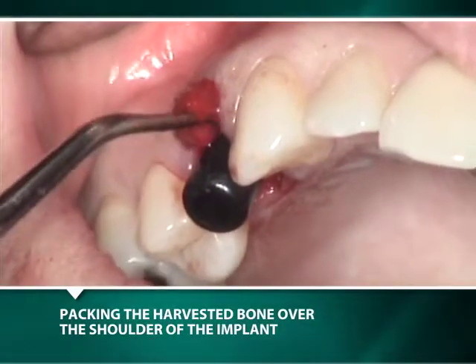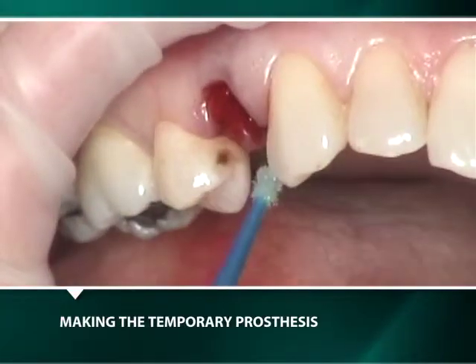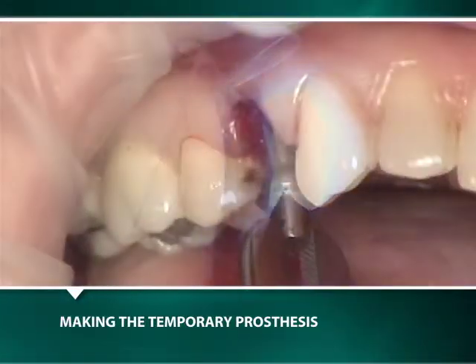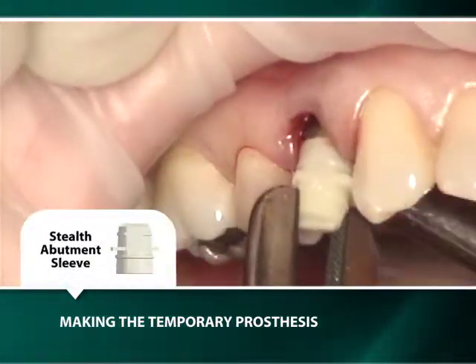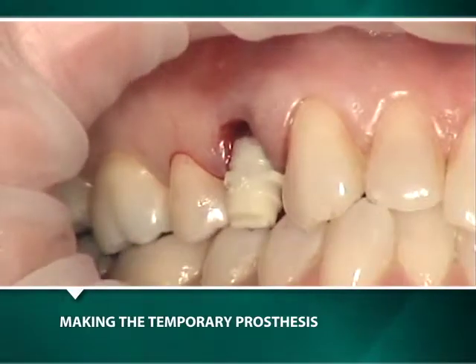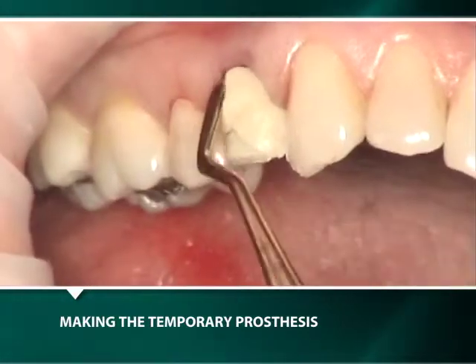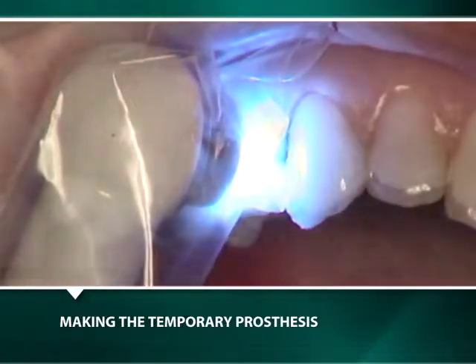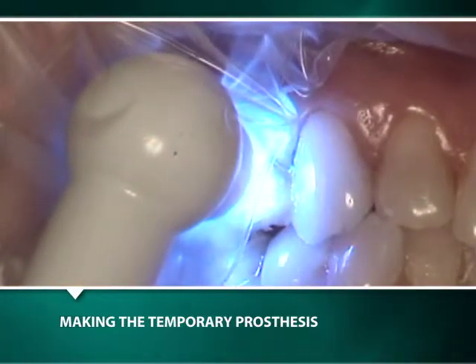Prior to the removal of the black healing plug, harvested bone is placed over the buccal shoulder of the implant. A bonding agent is placed and cured on the interproximal surfaces of the adjacent teeth prior to the insertion of a 5mm by 4mm zero-degree shoulder abutment in its corresponding acrylic sleeve for the fabrication of a light-cured polyceramic bonded temporary crown.